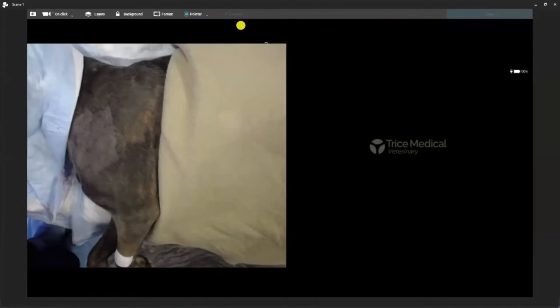The last thing people say is: that's great, you can diagnose things, but you can't treat with it. That is not necessarily true. We use this very commonly for national locations. When we go out to Seattle, the MyEye2 is actually used for treatments for shoulder, knees, elbows, and hips. I'll show you today portal placement as well as the ability to put in shavers and graspers, radiofrequency probes, biceps release, shoulder treatment, and so forth. So we'll get started — we'll do the shoulder first, then the elbow, and then the stifle as well.